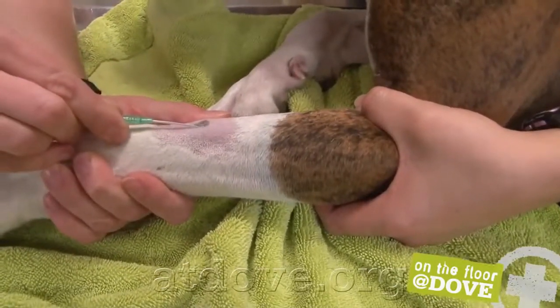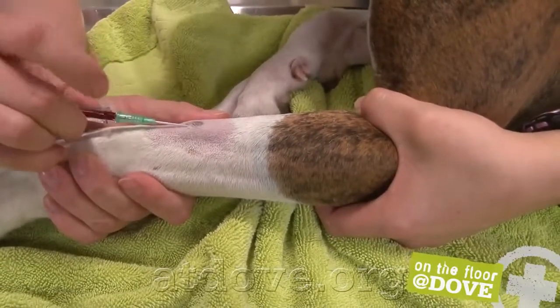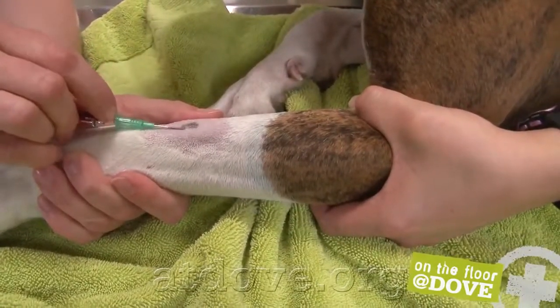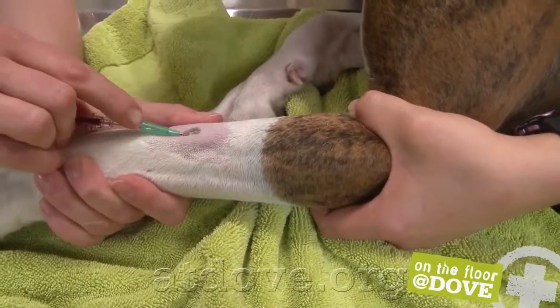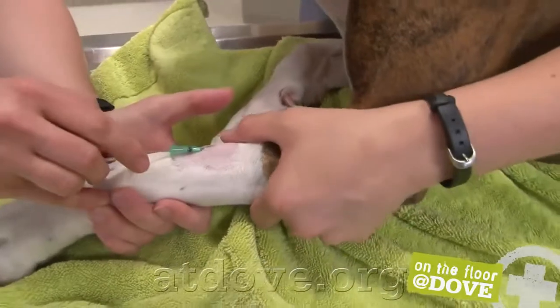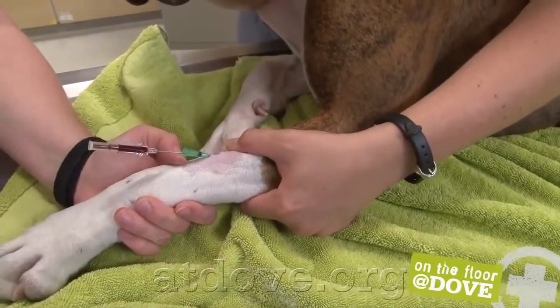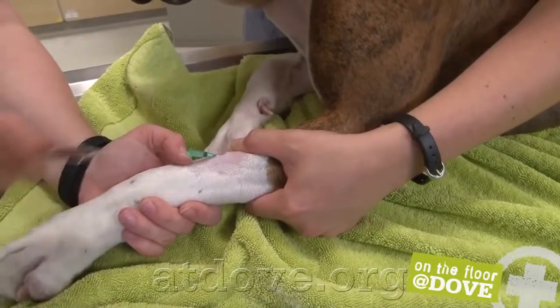See, the vein is moving around a little bit. Just get a nice conservative angle in there. Once I see blood in my stylet, I can go ahead and advance my catheter, squeezing through that skin. Catherine's going to put some pressure over the vein, careful not to touch where the catheter actually inserts in. I'm going to remove the stylet.